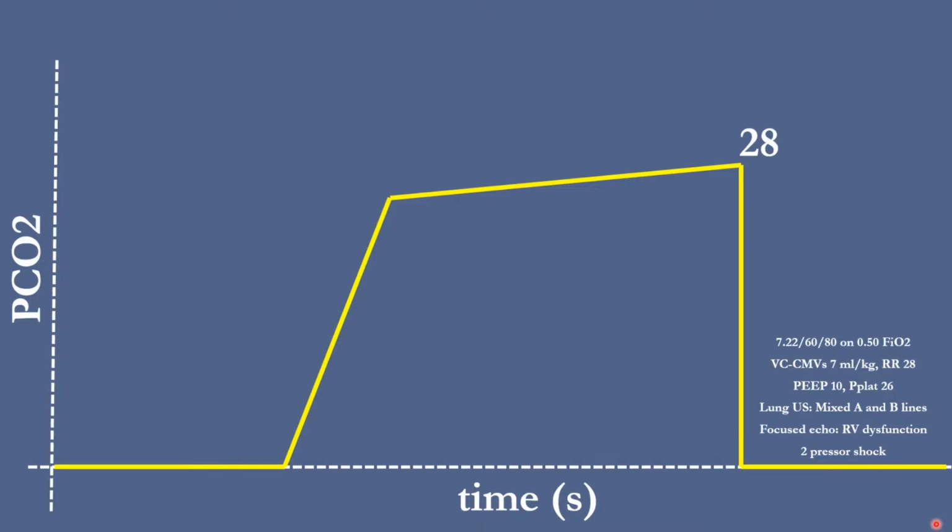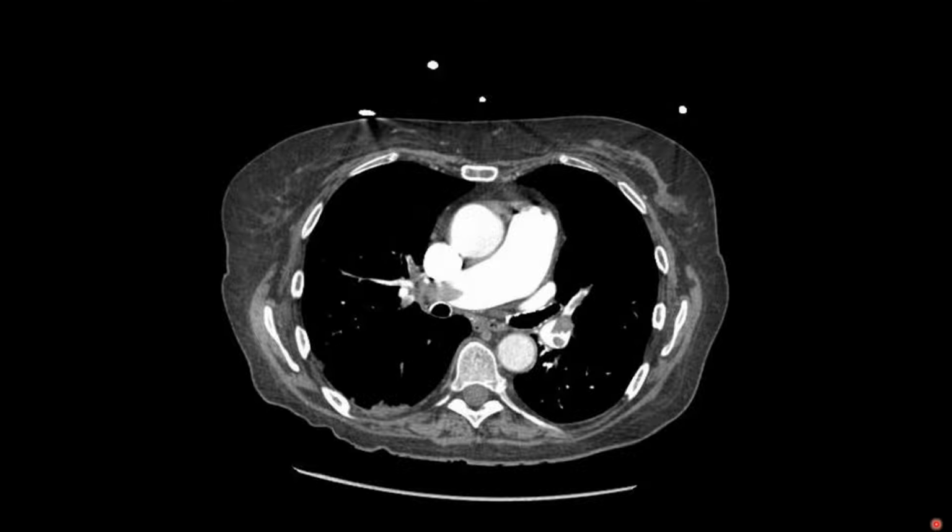So what struck me about this particular patient's case was I had somebody that had moderately severe impairment in gas exchange, but their pulmonary parenchyma didn't look all that bad. Their driving pressure's not through the roof, and there's a huge discrepancy between their end tidal value with a good waveform and their PaCO2. So at that time, we started to think about whether or not there was another reason for the dead space fraction to be increased. And indeed, in this case, we found large bilateral PE with some RV strain, for which this patient received tPA with some improvement in that dead space fraction.